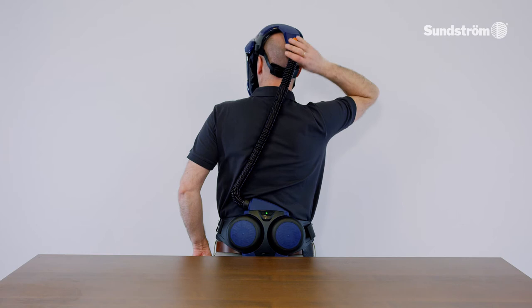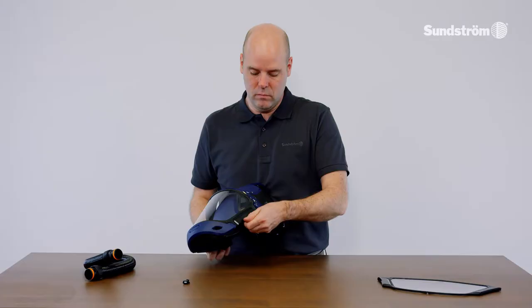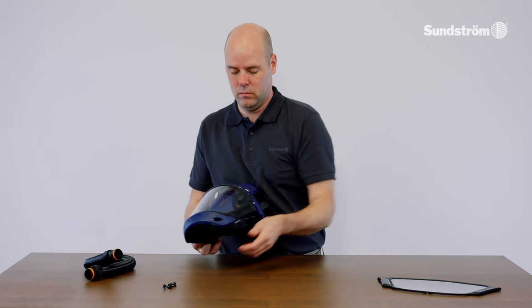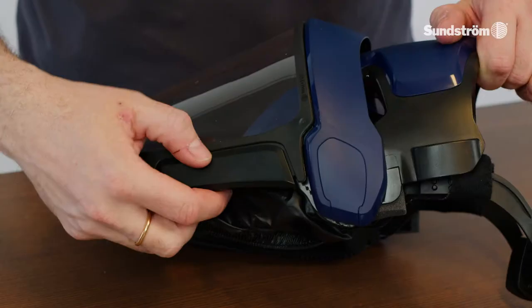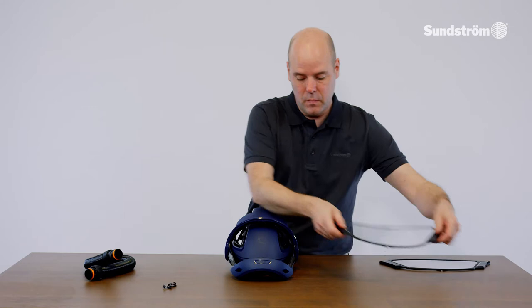Change the visor. Remove the peel-off clips. Release and remove the visor.